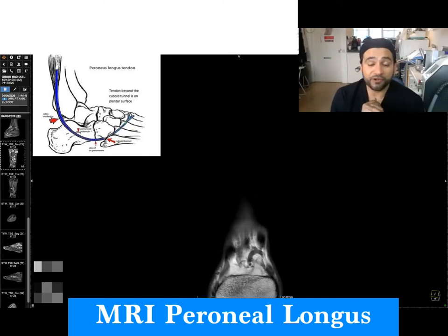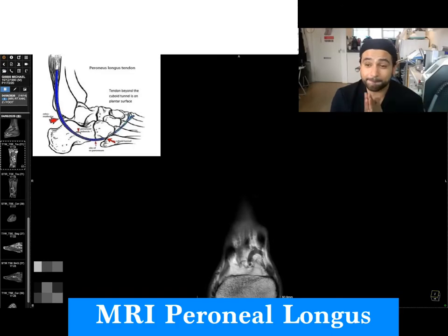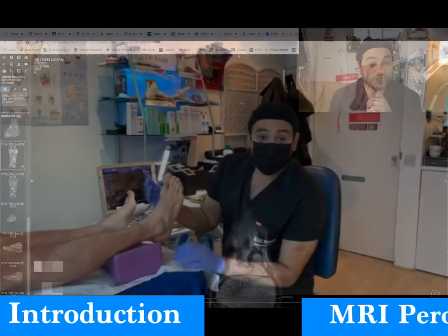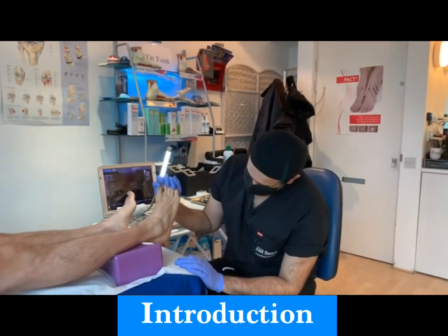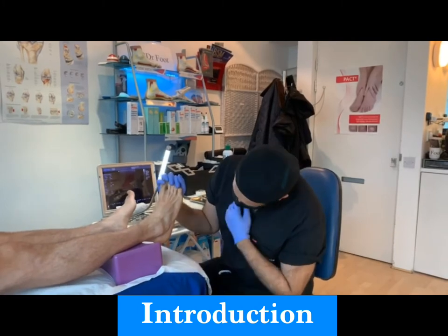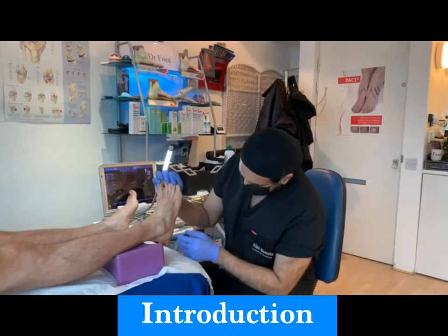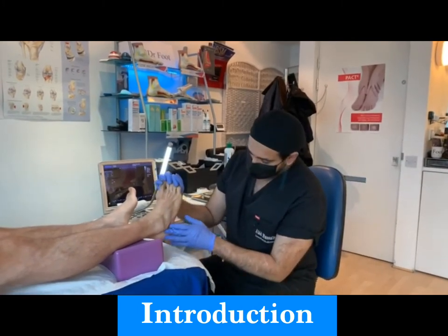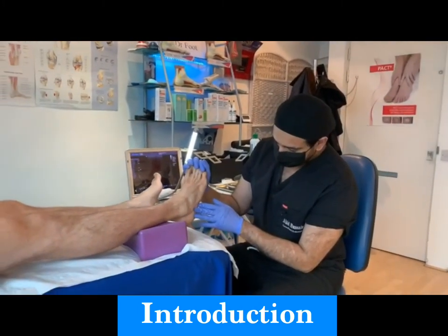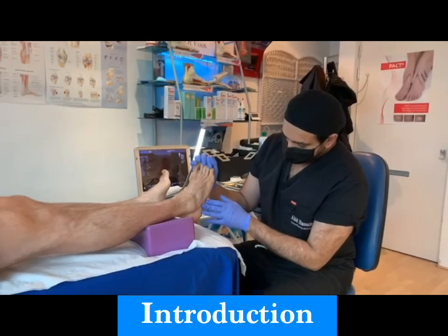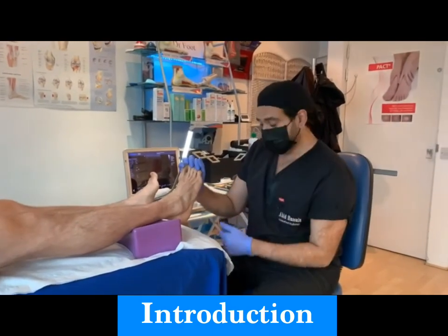So this should be really interesting. We are going to do this ultrasound guided. So let's have a look at what we can do. We are going to be doing an injection on this gentleman who's got peroneus longus tendinopathy. If you come a bit closer — I'm telling my cameraman to come across.